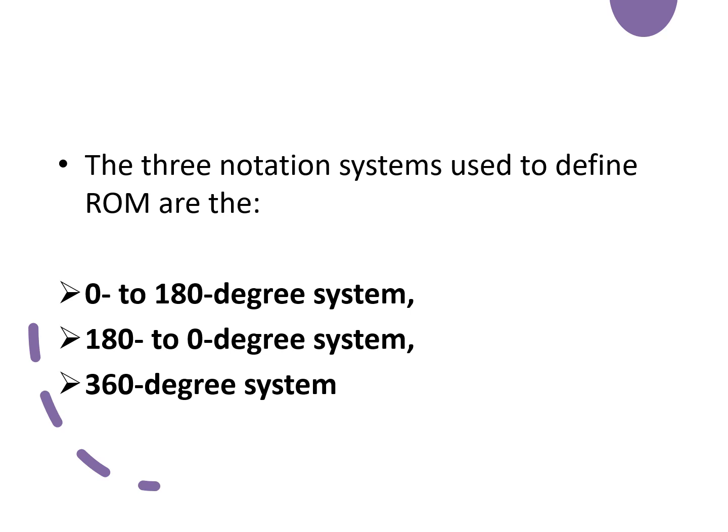There are three notation systems used to document any range of motion. The first one is 0 to 180 degrees. You are sitting or standing with your arm in neutral position. From there you take it up and above, and you complete the full range of motion with the arm coming towards your head.